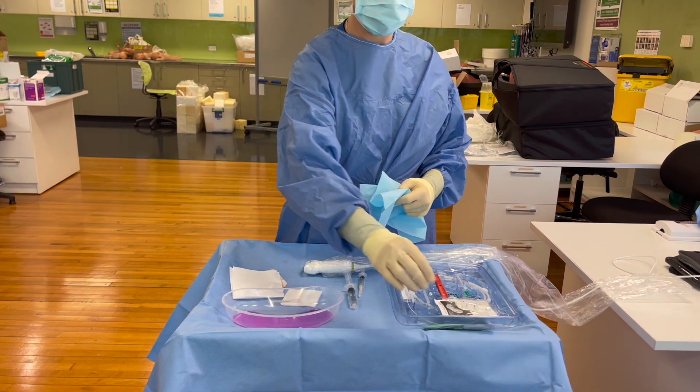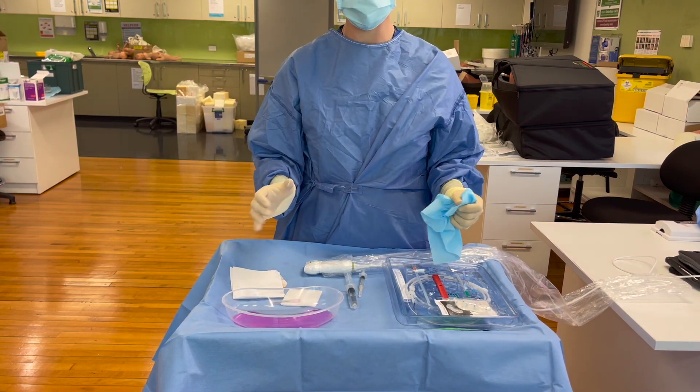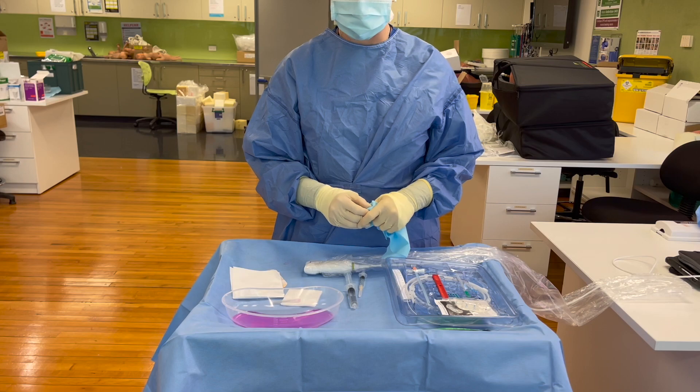Keep your sterile gel ready for when your patient is prepped and draped and you're ready to use it.